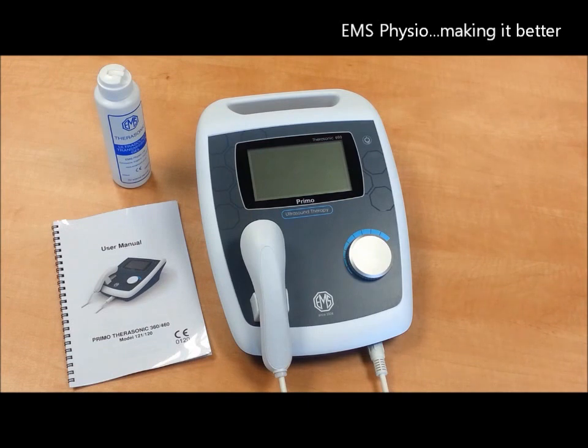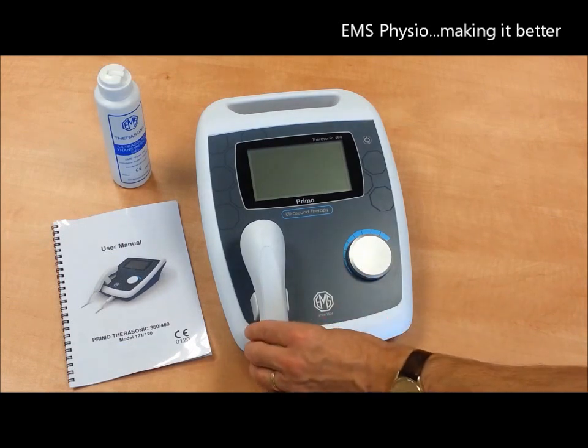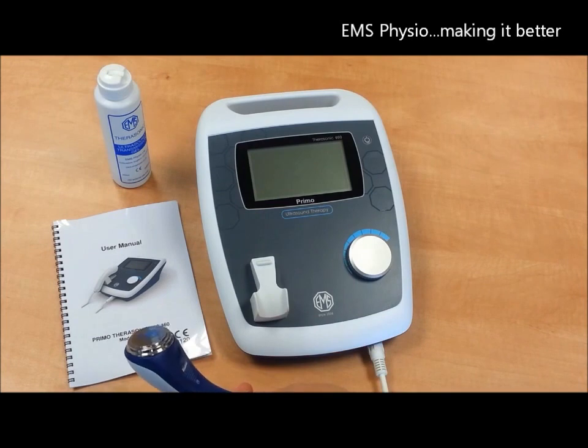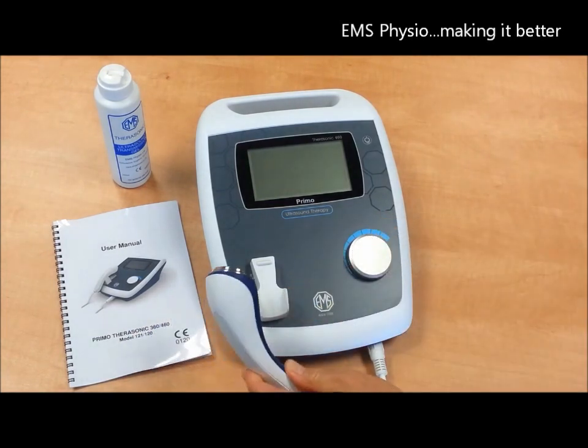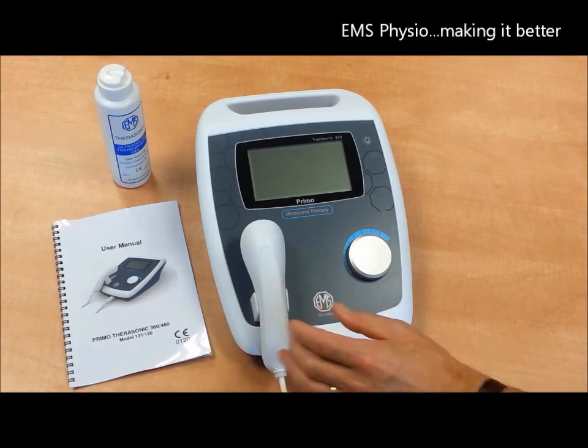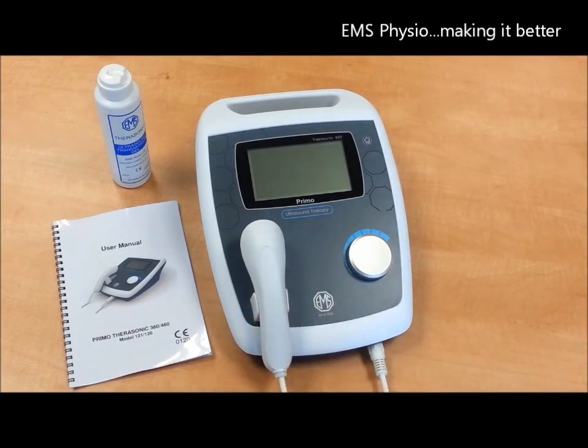First, plug the treatment head into the socket at the front of the device, ensuring the arrow on the plug is at the top. Then rest the treatment head on the cradle on the top of the unit itself, and you should feel a definite fit when the head is engaged in the holder.